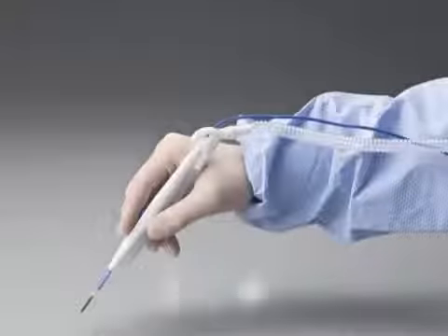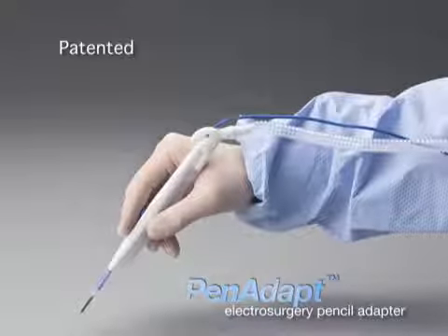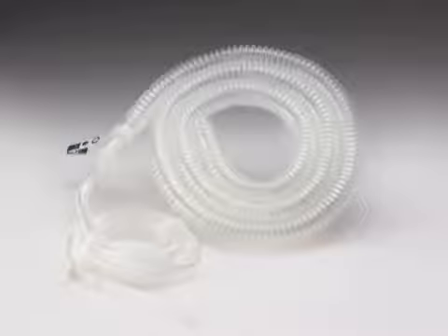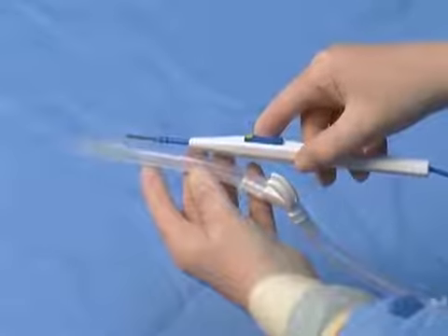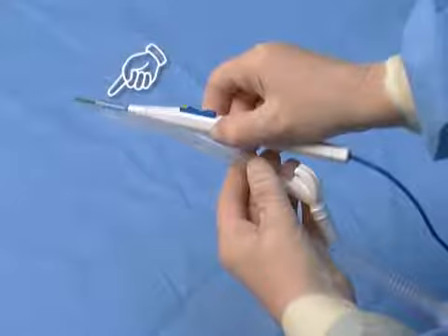An alternative to an open hose configuration is to utilize a PenAdapt electrosurgery pencil adapter. The PenAdapt is universally designed to fit over most electrosurgical pencils. Consult your Buffalo Filter representative to ensure a proper fit to your application. Simply insert the electrode from the electrosurgical pencil into the PenAdapt and allow it to puncture the membrane in the adapter and continue inserting it until the electrosurgical pencil is fully seated into the opening of the PenAdapt.